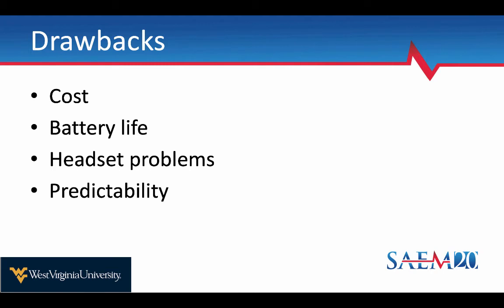So being plugged in to a health sciences center or a bigger university definitely makes this accessible, but that's going to limit some of its utilization more generally. The other thing some of the students mentioned, and we saw, is that after you get one or two views, you kind of know where they are, right? So it's a little bit predictable. Now, as more software is introduced that allows different and more cases to be implemented using this AR technology, I think that will change and improve a little bit.